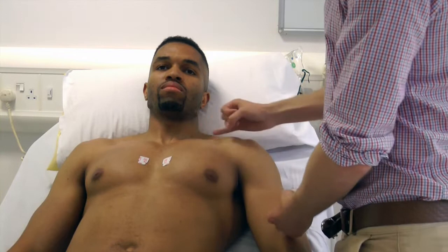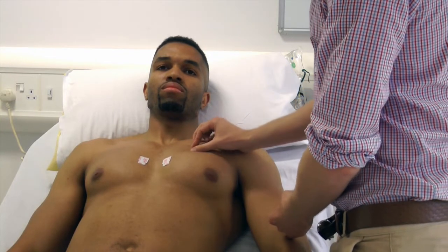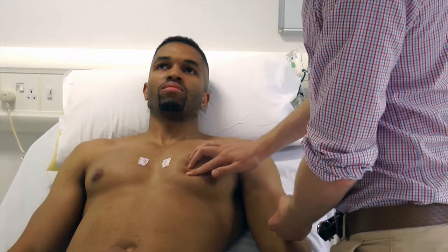Now place chest lead V4. This needs to be in the mid-clavicular line in the 5th intercostal space. Have the sticker to hand so you can place it once you have located your anatomical landmark.